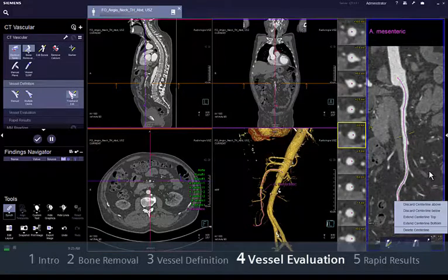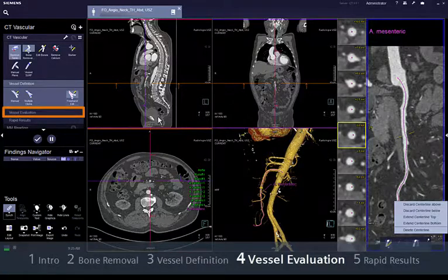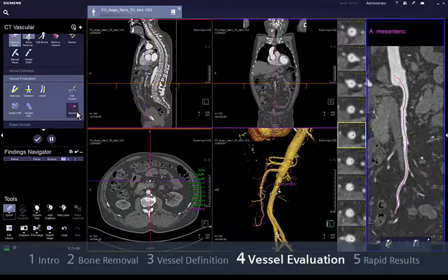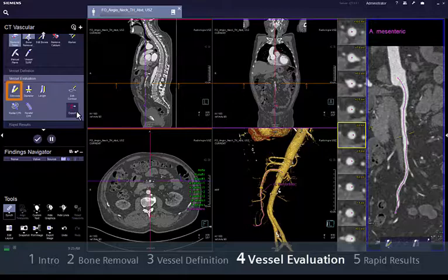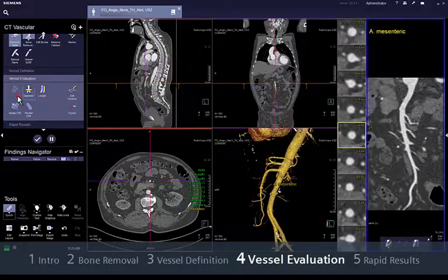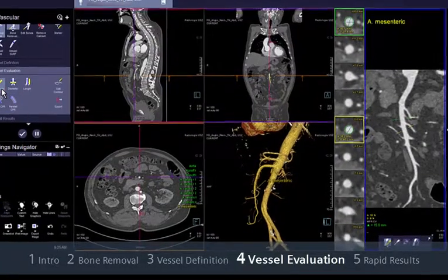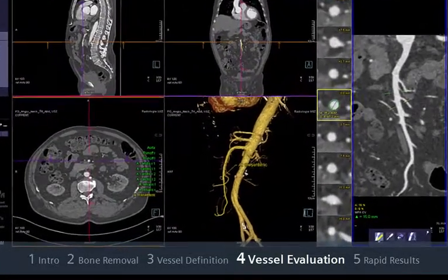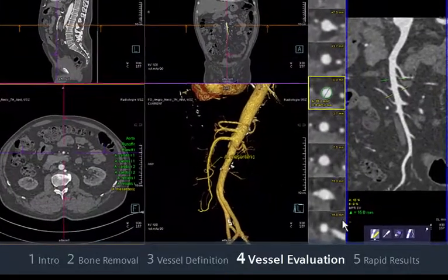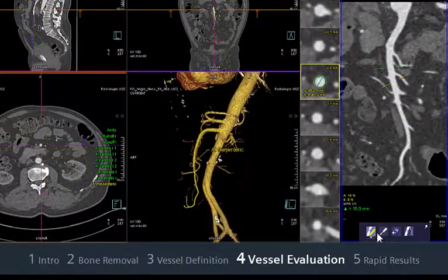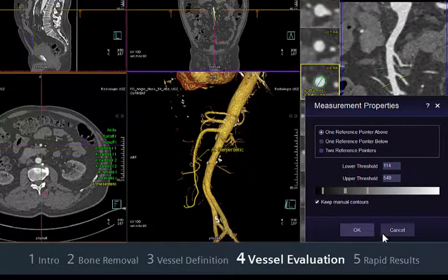In the following workflow step, Vessel Evaluation, you will find some tools in case quantification is needed — for example, for assessing the severity of a stenosis or planning stent placement. Click on the Stenosis measurement tool; notice that you can also find it in the mini toolbar. That will activate three or two references, depending on the properties of the tool.